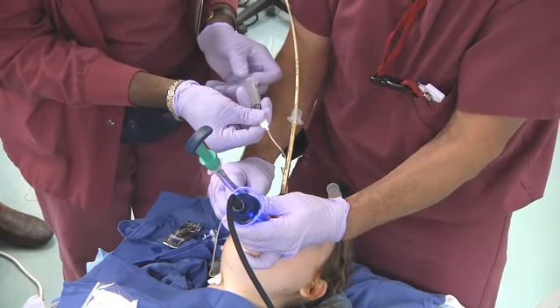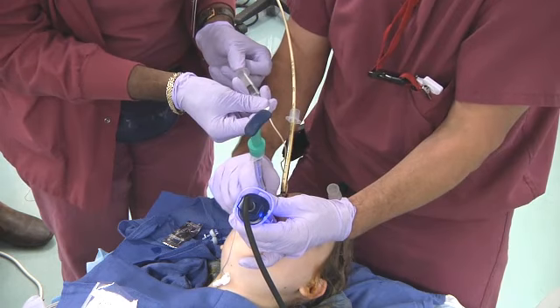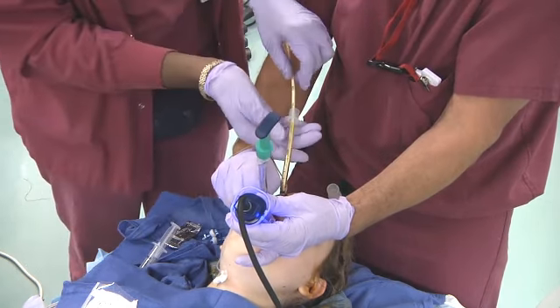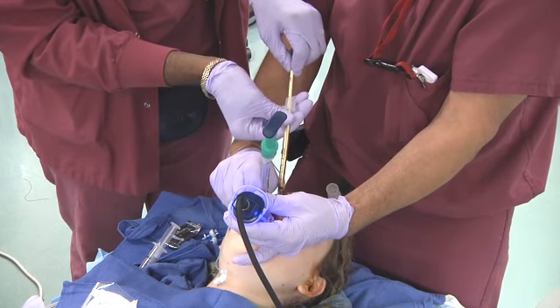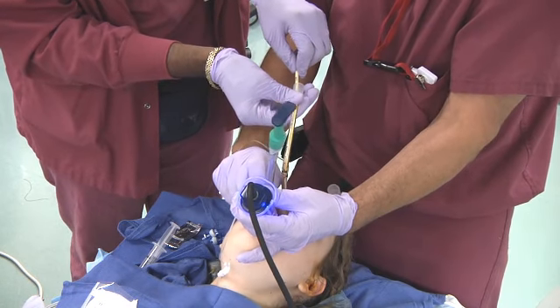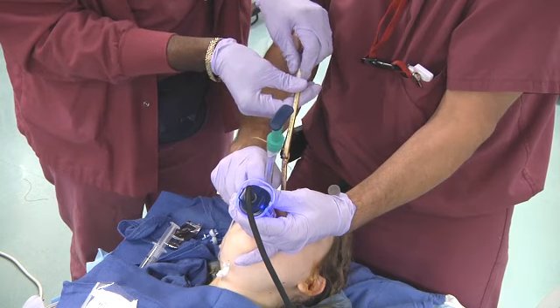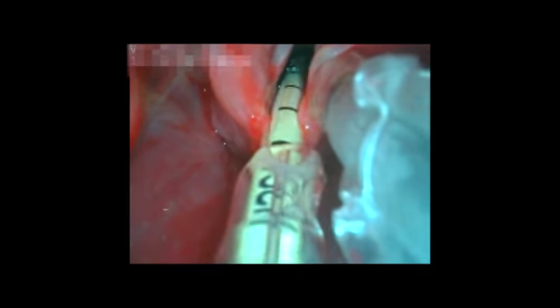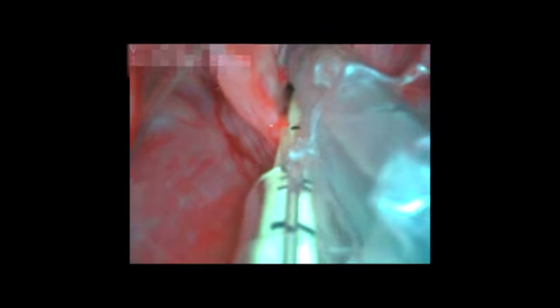The nasal tracheal tube will now be withdrawn out of the larynx, leaving the airway exchange catheter in situ. Once the nasotracheal tube has been removed from the larynx, as seen with the indirect laryngoscope, the oral tracheal tube will be advanced.